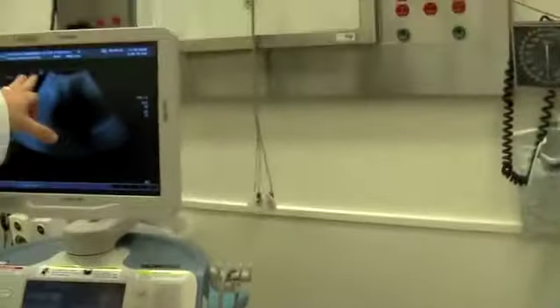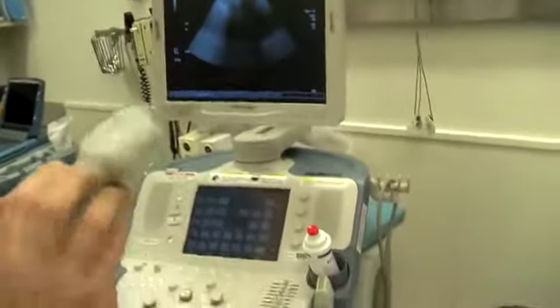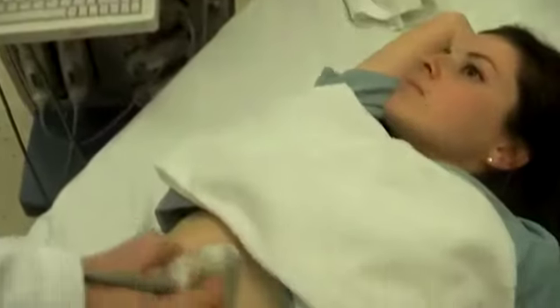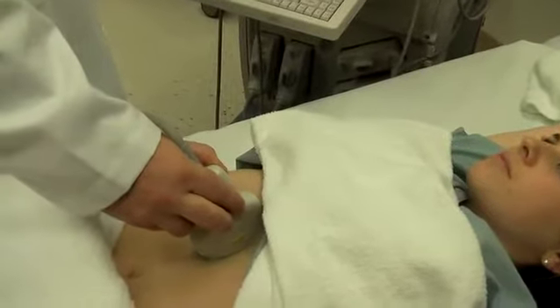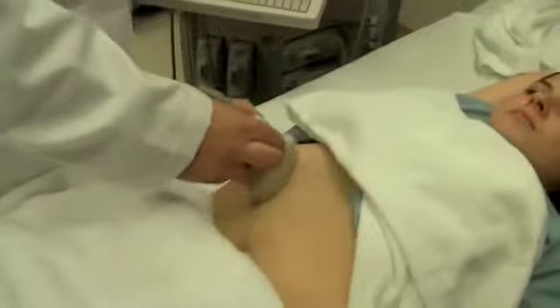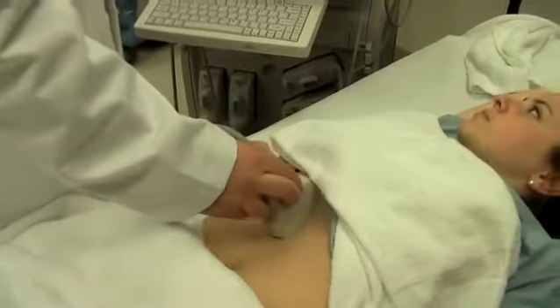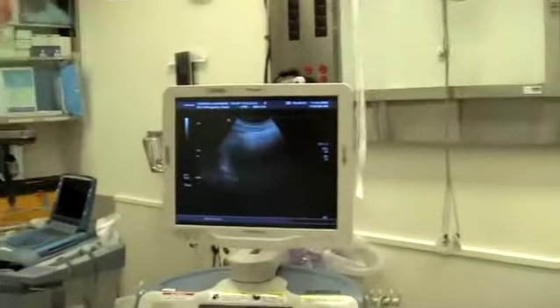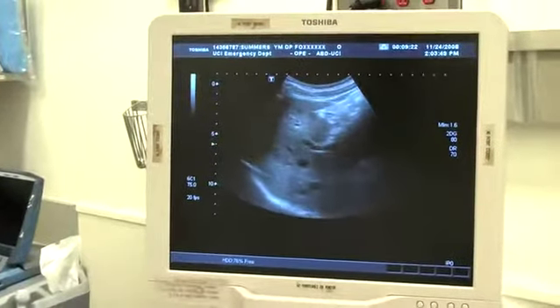I'm very cognizant of where the indicator is, and we're going to do what's called a subcostal sweep, which is we're going to start in the subxiphoid recess here, and we're going to scan over in a sagittal plane, because it's sagittal because the indicator is to the patient's head, and we're going to scan over subcostally through the liver until I see the gallbladder. Now look, I don't really see a whole lot, I just see a lot of gas. One way, and I have to do this a lot with gallbladder scans, to optimize your view is to have the patient take a deep breath, because it'll bring the gallbladder fossa out underneath the ribs.